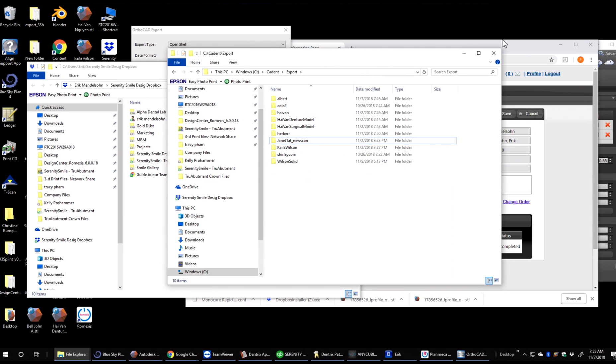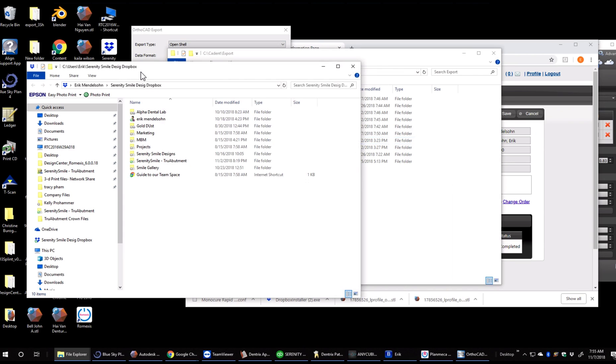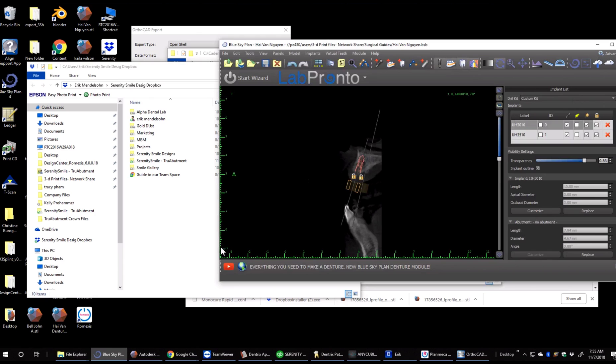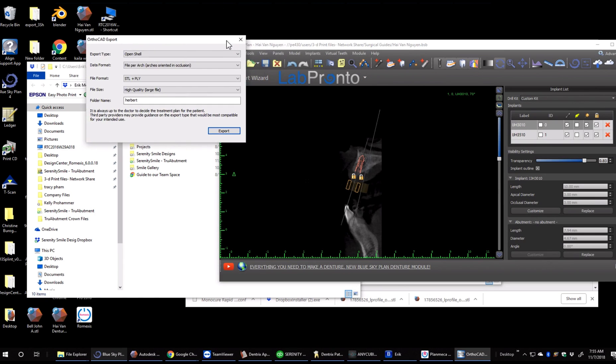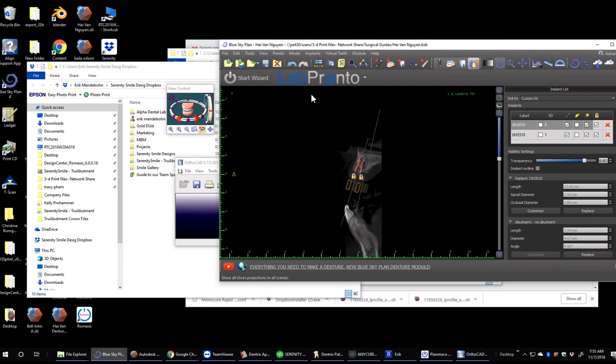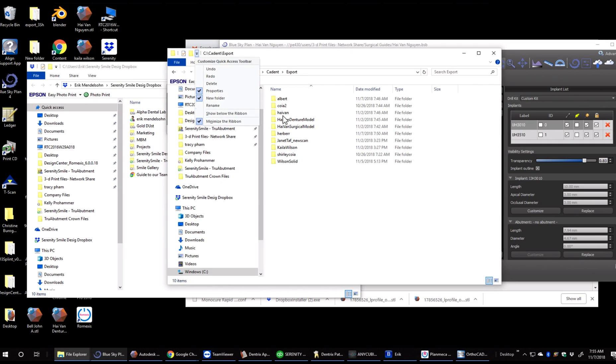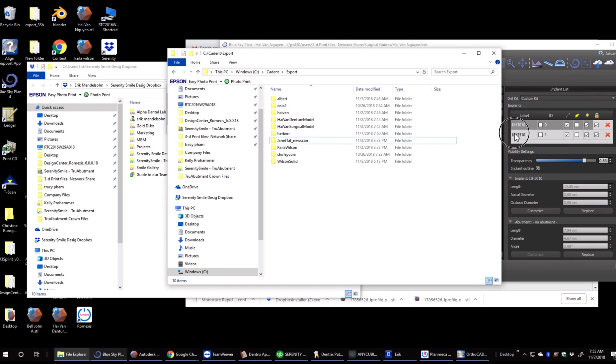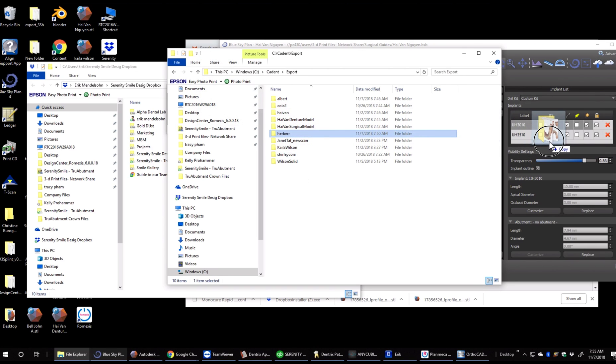We can also take that same file and drag it directly into BlueSkyBio. So if we needed to drag it into BlueSkyBio, we would essentially take that file or any file, drag it in. You see it will copy and open up right there.